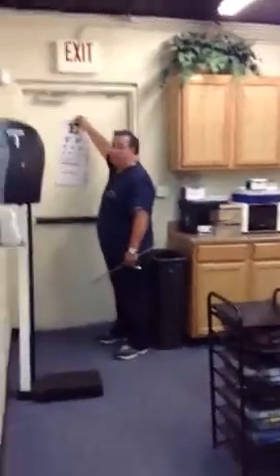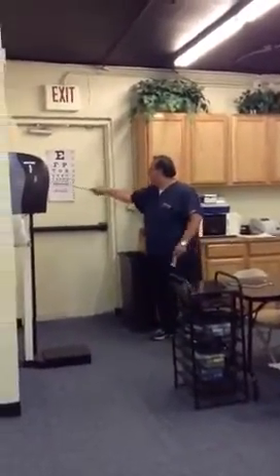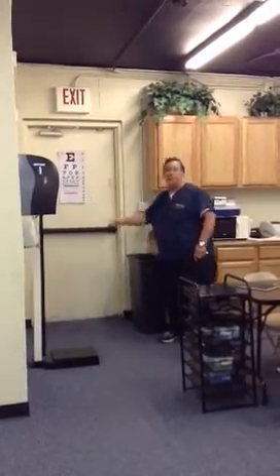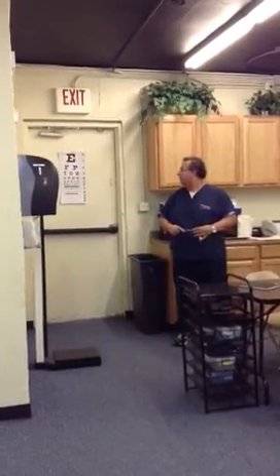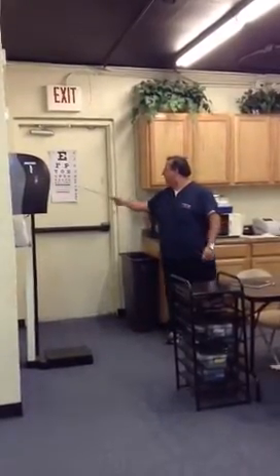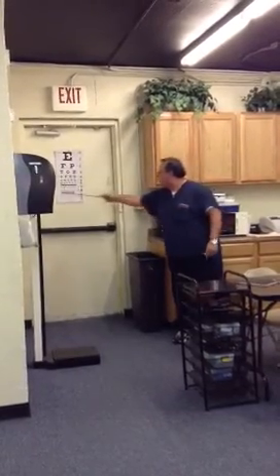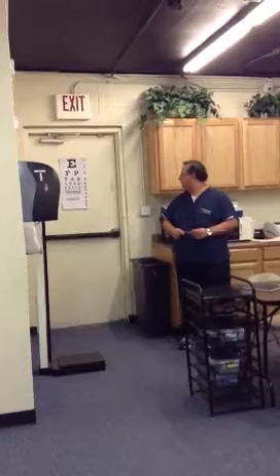Now I'm going to have you cover your right eye and we're going to test your left eye. Remember: don't touch your eye with the cover, don't squint, don't lean forward, and don't step forward. So reading with your left eye — line four, going backwards: D-E-P-L. Very good. Line five, also backwards: D-F-C-E-P. Line six, going forward: E-D-F-C-Z-P. Very good. Line seven, also forward: F-E-L-O-P-Z-D. Very good. Line eight, backwards: C-E-T-O-P-F-E-D. Very good.